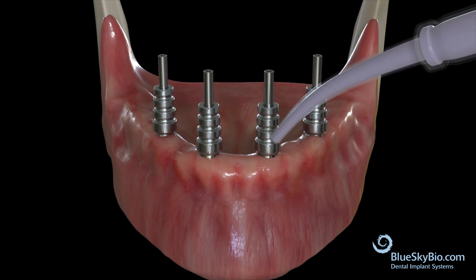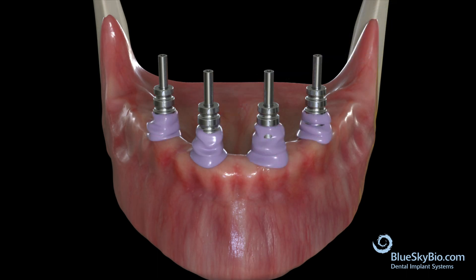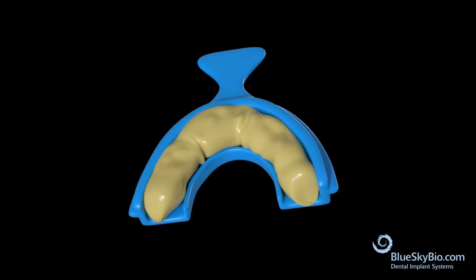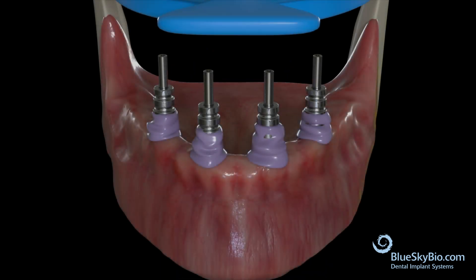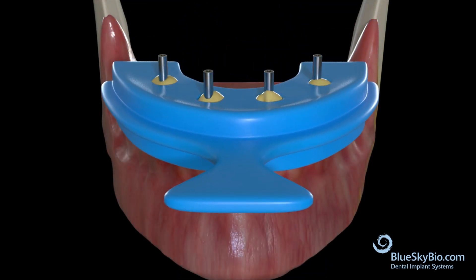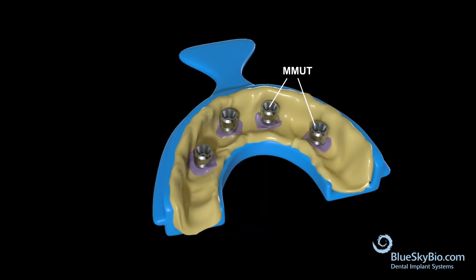Squirt medium body PVS around each impression transfer and then fill your tray with heavy body PVS. Fully seat the tray, being sure that the impression transfer screws are protruding through the holes in the tray. Once the material has fully set, remove the screws and take the impression out of the mouth. Now send the impression to the lab.